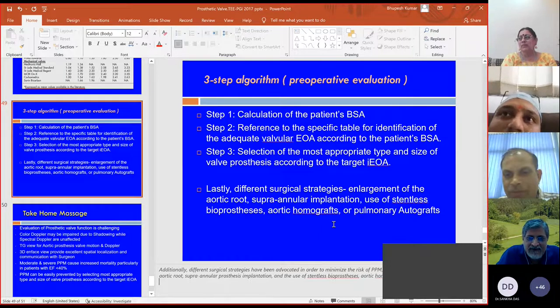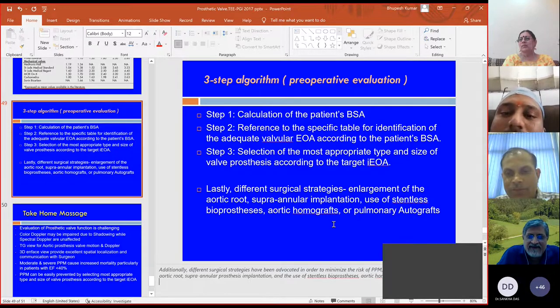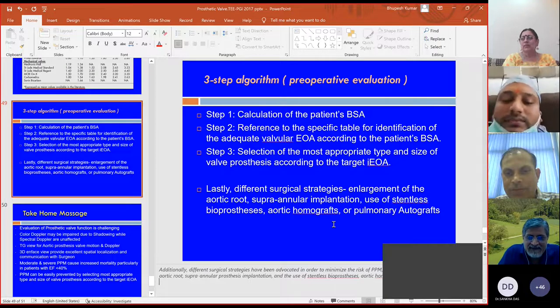Then if you come to the commissural view, the right-hand side will be at 9 o'clock. The other side will become 3 o'clock. And if you come to the four-chamber view, the right-hand side will be 8 o'clock, and the reverse will be 2 o'clock. So you can imagine either right side or left side. From 12 o'clock to 10 o'clock, 9 o'clock, and 8 o'clock, and then the other side will be the opposite way. It is just very simple.